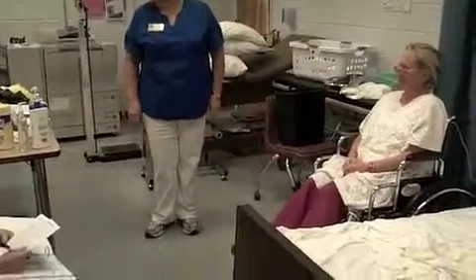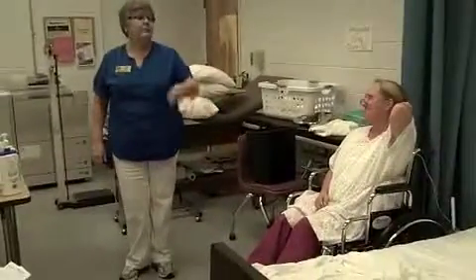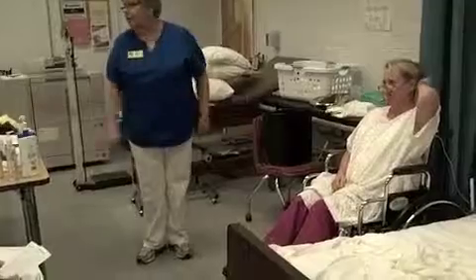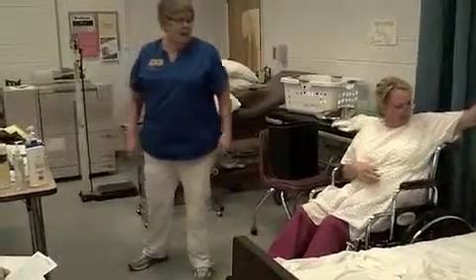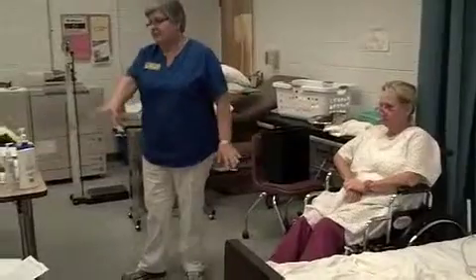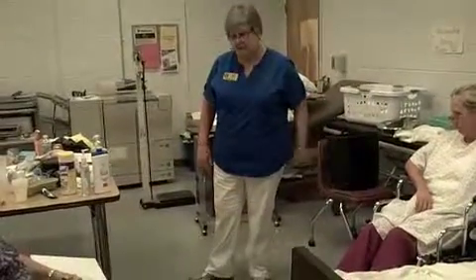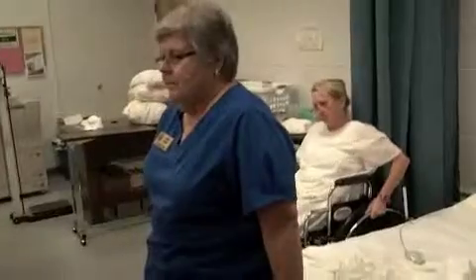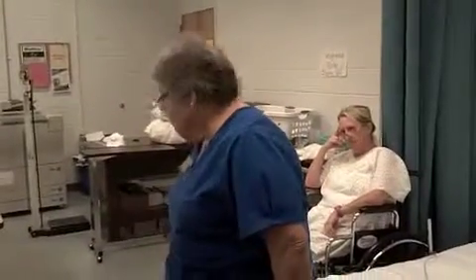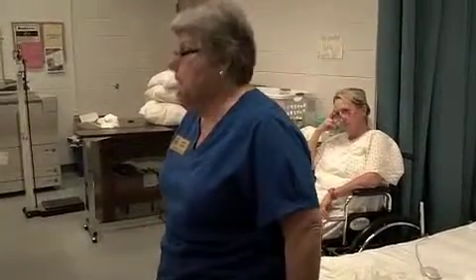Does it say anything about locking that chair after the transfer? It doesn't matter — you're going to have patients that can wheel themselves around that room. She might want to wheel herself over there and get her iPad. So that part doesn't matter because it doesn't say, so it doesn't matter. But it does matter that it's locked when they make that transfer. Where do you see landmines? There's a bunch of them in this one. Your thumbs are locked — yes. If they will hook lock bed and lock chair together in their mind — lock bed, lock chair — it doesn't matter which order, but get them both.